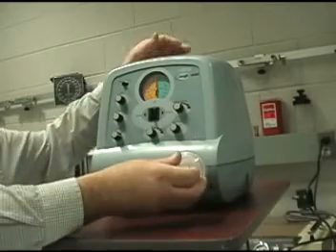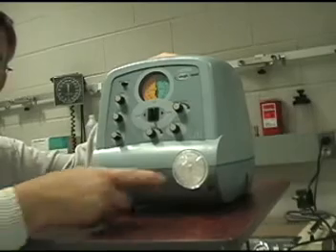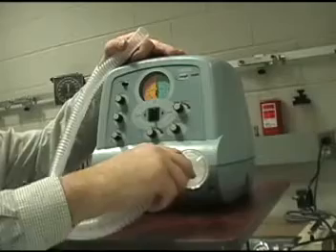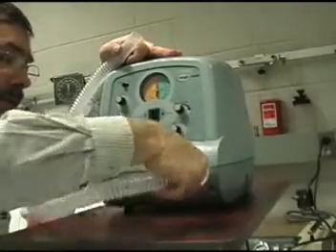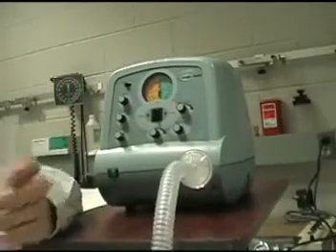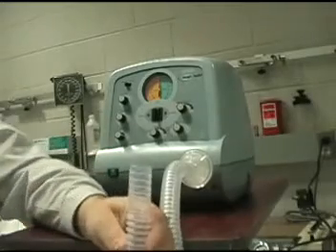This is normal sizing, so any bacterial filter will fit. Now you're going to connect your tubing here to the filter. And now you're pretty much set with the exception that you need your patient adapter.